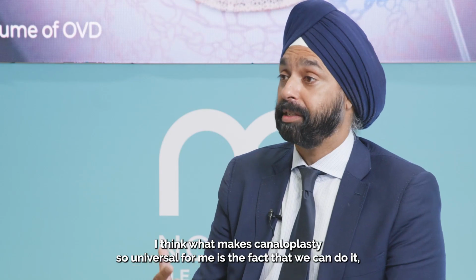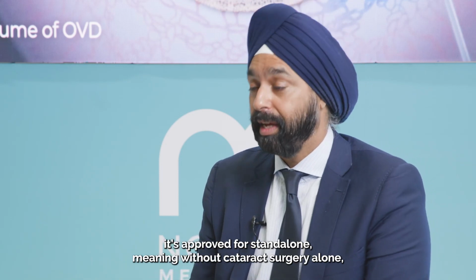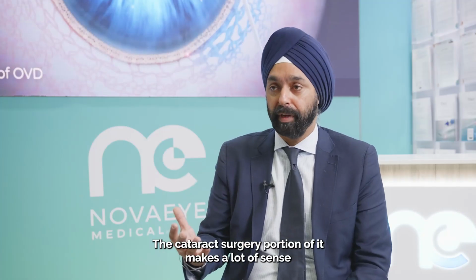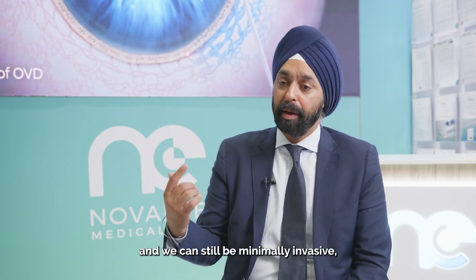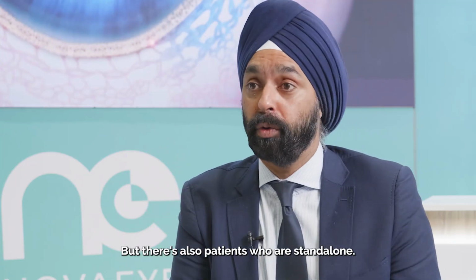I think what makes canaloplasty so universal for me is the fact that it's approved for standalone, meaning just without cataract surgery alone, or at the time of cataract surgery as well. The cataract surgery portion of it makes a lot of sense because you're taking out the cataract, you're already there. As we all know, patients are happy having their cataract taken care of, and we can still be minimally invasive, open up the conventional pathway. But there's also patients who are standalone.